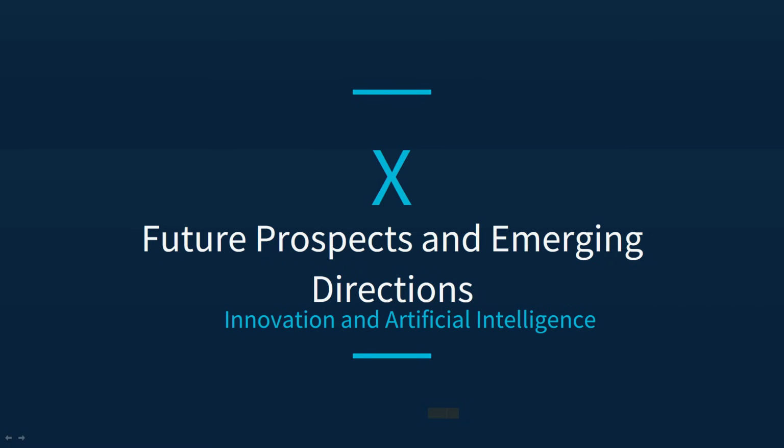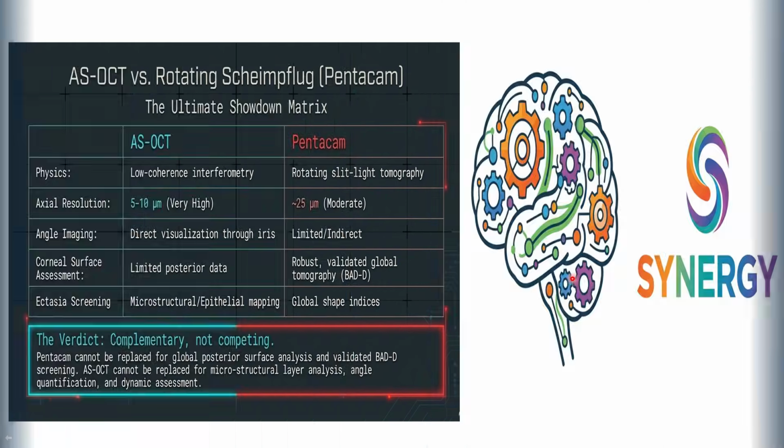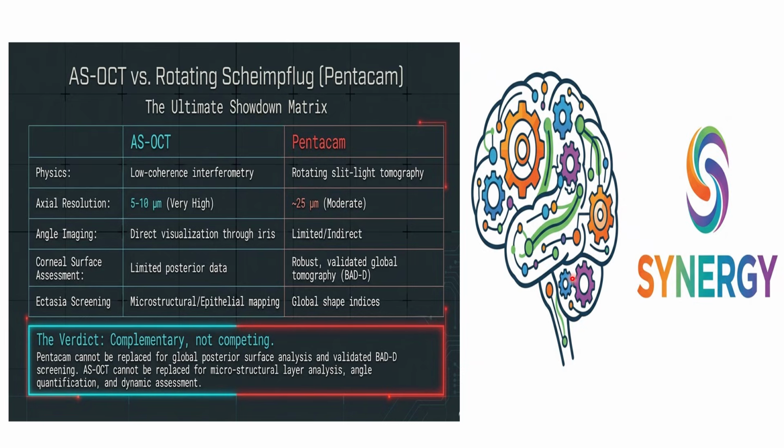Now we reach the final section of this lecture regarding the future prospect of this newly emerging technology and other competitors like the Scheimpflug technology or the Pentacam. As you know, the new trend and the future prospect of this technology is not that one replaces the other.